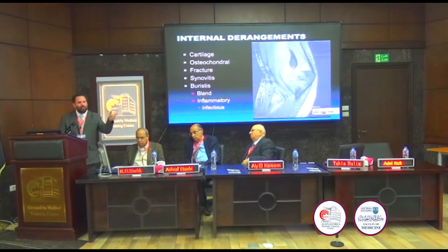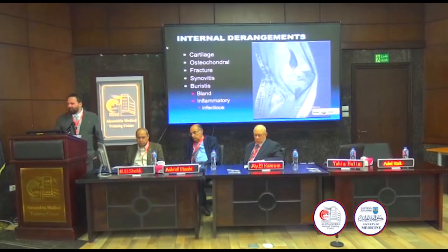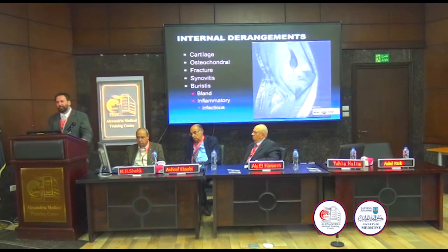Now, if I put, rather than one or two drops, five, six, seven, or eight drops, the water would pool around the cover slip, because there's too much water there. And pooling around the cover slip is going into joint recesses. So if we start seeing fluid in the posterior recess where we see fat bands, or the anterior recess, or the annular recess, that's abnormal. In the elbow and in every other joint, if I see fluid in recesses, that's a sign of abnormality.